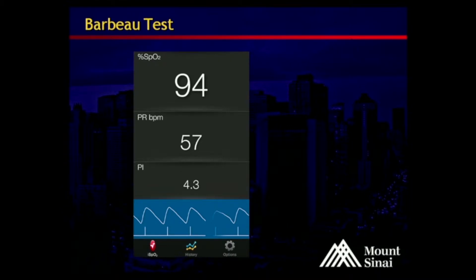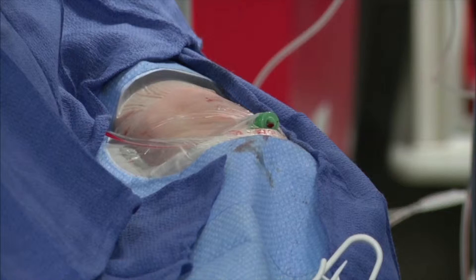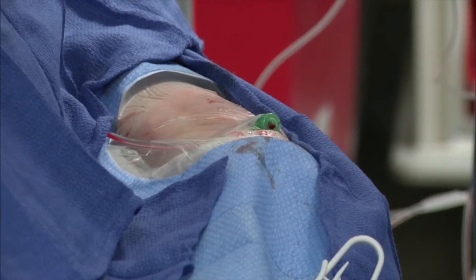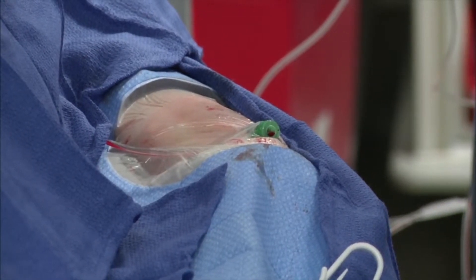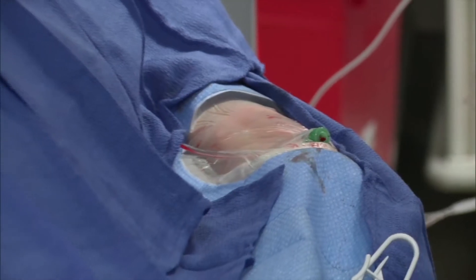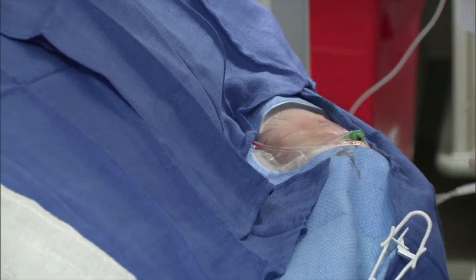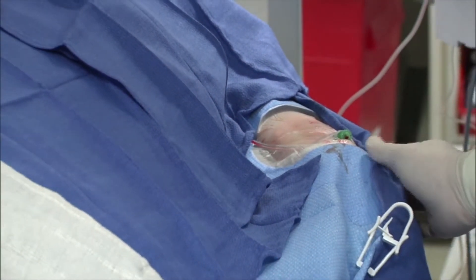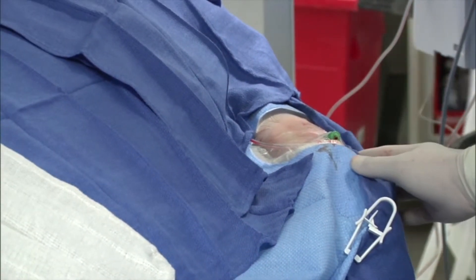Prior to the procedure, we performed a Barbeau test using an iPhone app with a portable pulse oximeter. She has a Barbeau A result, which is quite suitable for radial access. The arm is positioned to the side using a towel as a rest.